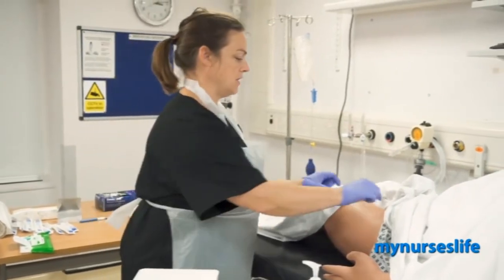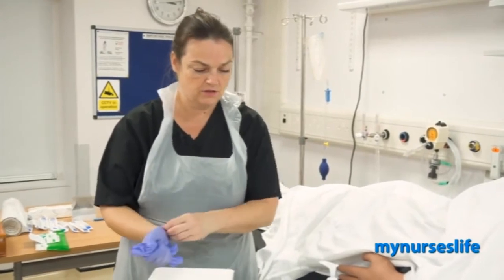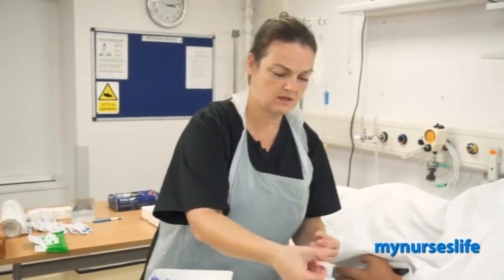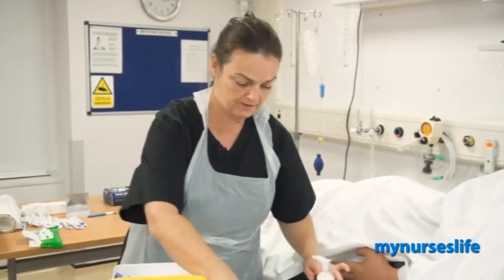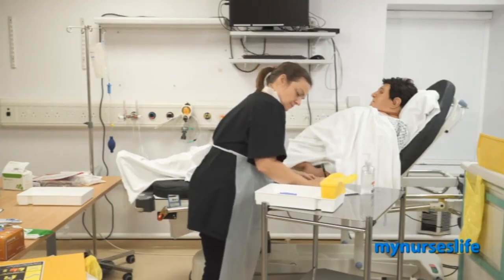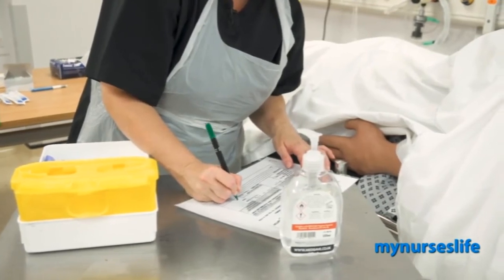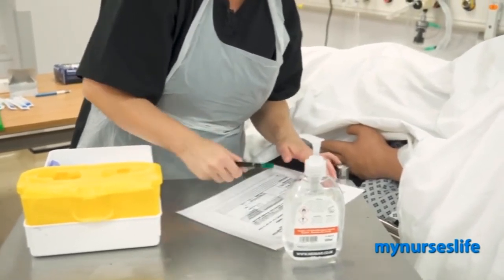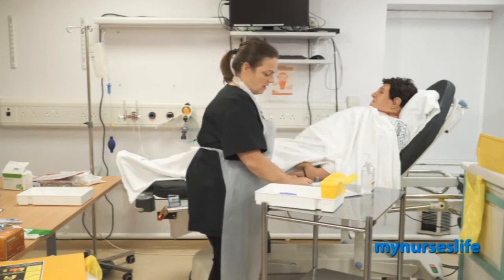Okay, I'm just going to put your clothes back. Right, Emma, that's all done. Just sign. Just going to gel my hands and sign for the medication. Put the date and the time in. And okay. So if there's an area asking for extra information, I would write the area that I've injected it, which would be her left thigh.